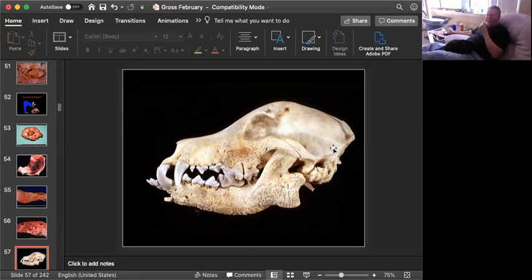Histologically, boy, it is really tough. Even if you take a normal section through the jaw, there's bone going every which way and remodeling in all sorts of crazy ways. And I will take it that people who look at a lot of jaws can really get turned around on badly taken sections because the bone just proliferates. And then when you get a disease like this, craniomandibular osteopathy, on top of that, it's just absolutely crazy.